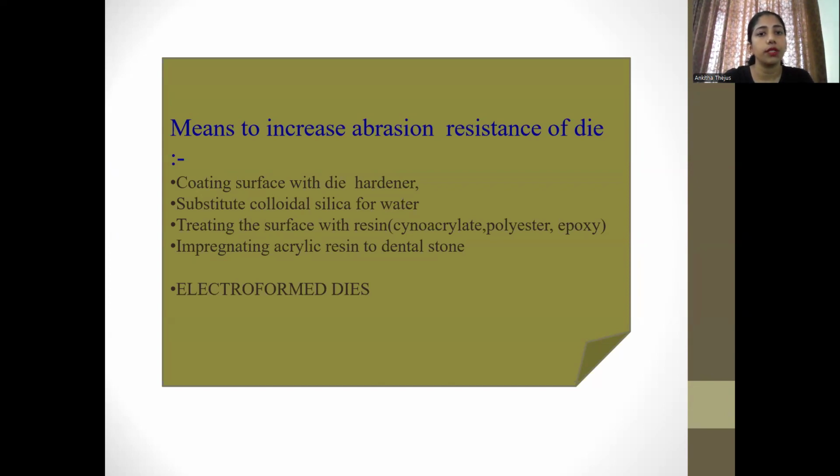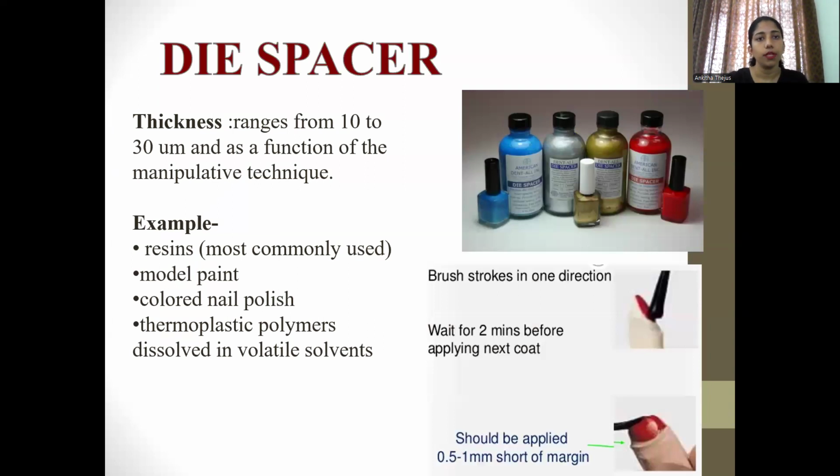First, coating the surface with a die hardener. Second is substituting colloidal silica for water. Third one is treating the surface with resin. Usually you'll be using cyanoacrylate, polyester or epoxy resins. Fourth is impregnating acrylic resin into dental stone.